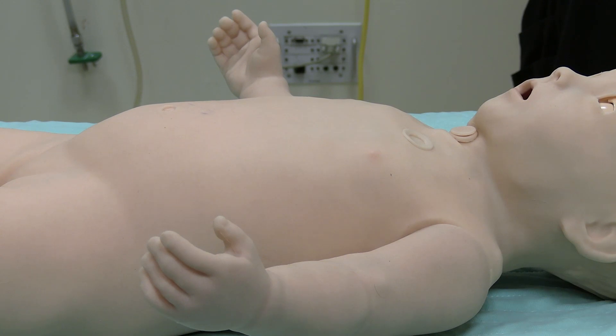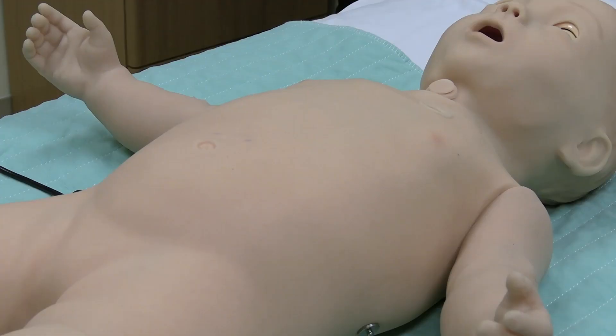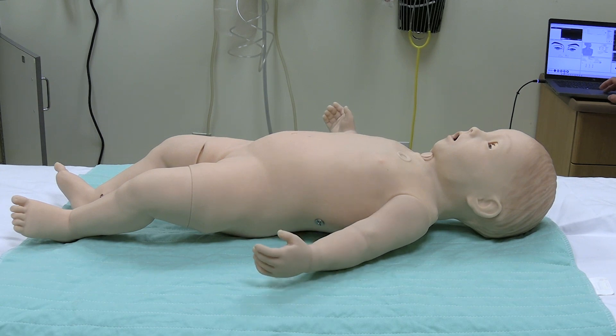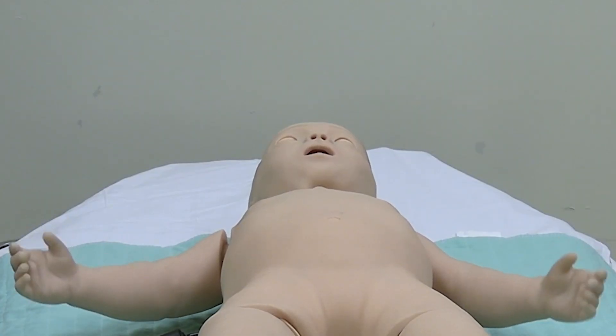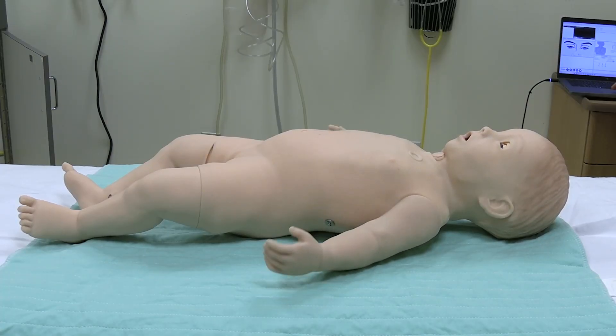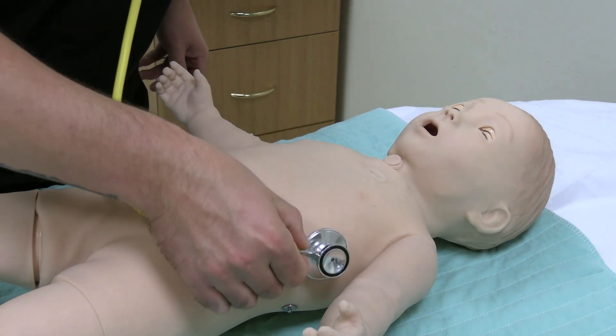There are three available breathing patterns: normal, retraction, and seesaw. SimBaby also has different motion features including normal healthy baby and seizure. Heart and lung sounds can also be heard with a stethoscope and customized for any particular condition.